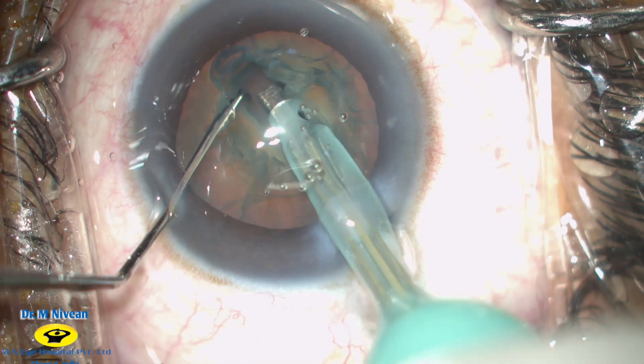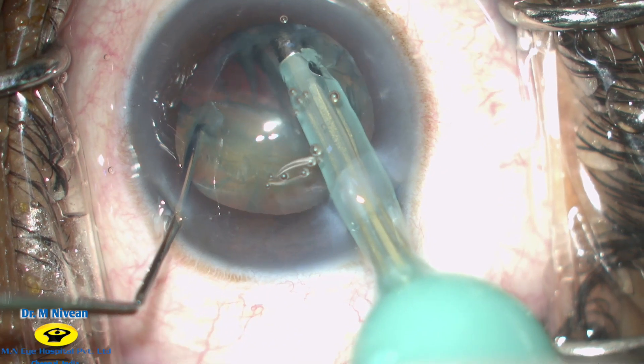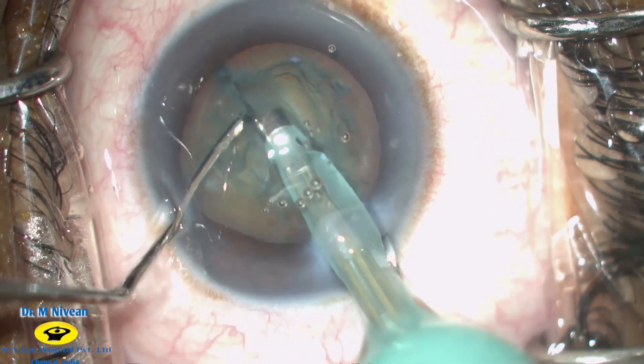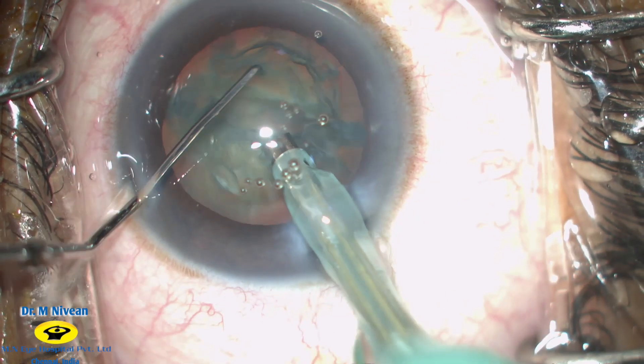Once the red reflex can be appreciated, cracking can then be initiated. The nucleus is then rotated 180 degrees and the crack is completed on the opposite pole as well. Now we have two complete halves of the nucleus.